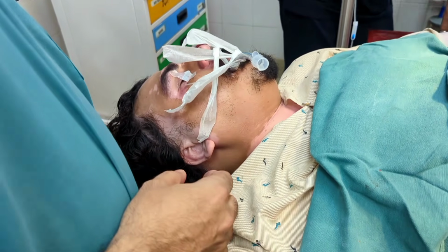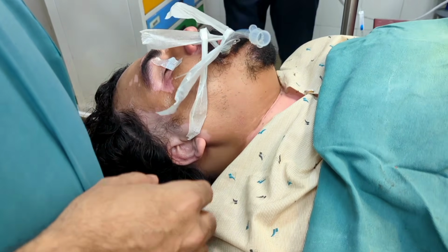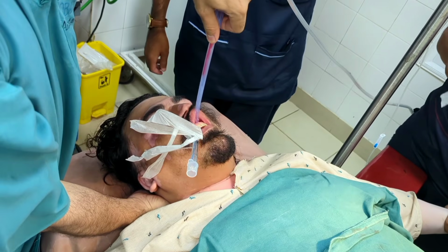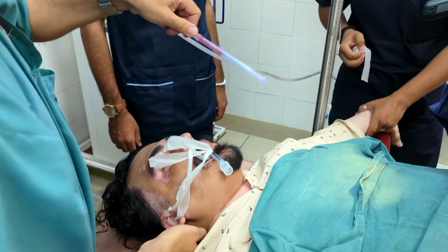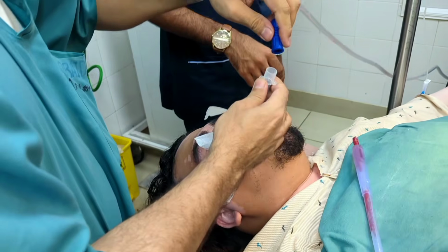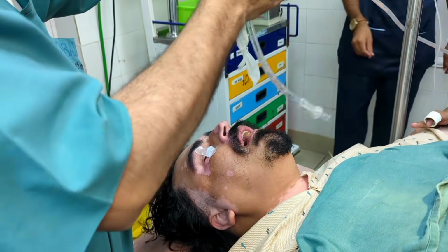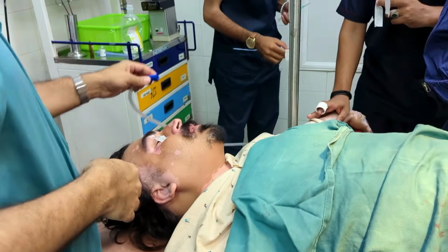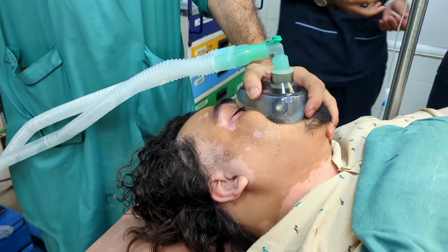To maintain a clear airway and prevent any obstruction, gentle suctioning was performed to remove any secretions present in the mouth and trachea. This ensured smooth airflow and proper oxygenation during the recovery phase. Once the patient showed consistent respiratory effort, the endotracheal tube was removed carefully with the help of suction. Extubation was performed only after confirming that the patient had adequate breathing and was able to maintain oxygen saturation without support. This step is very crucial, as premature removal of the tube can compromise the airway.